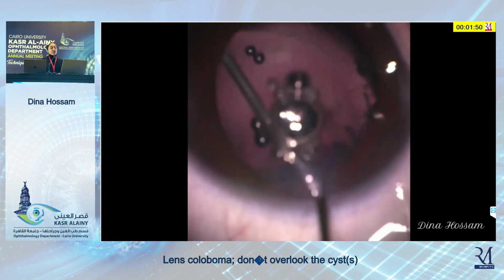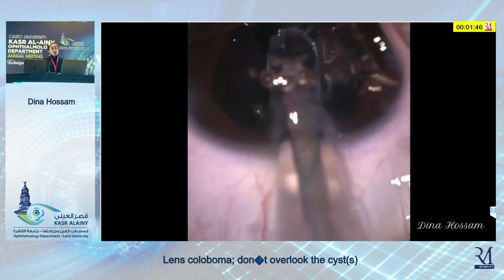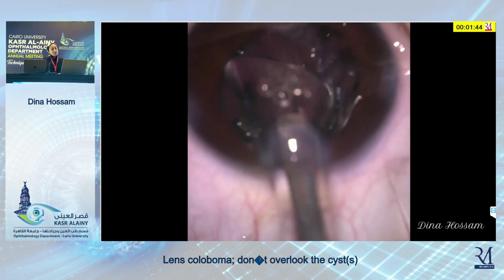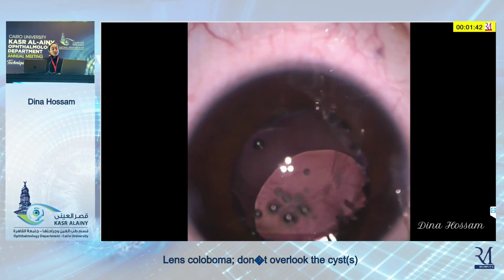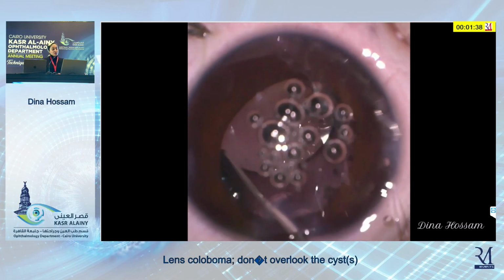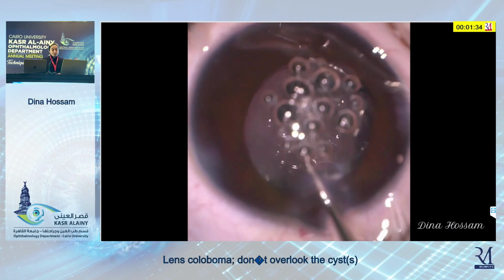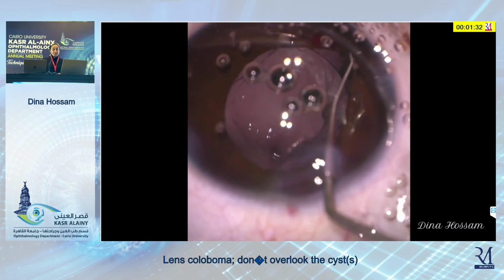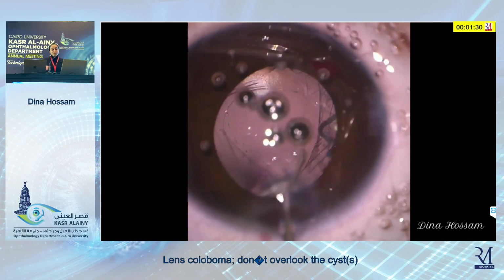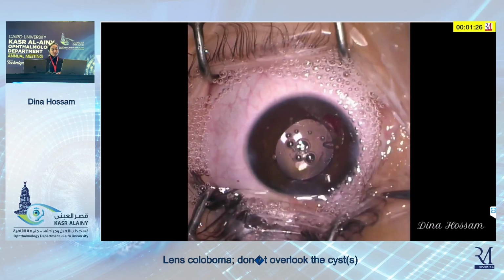And now you have an intact anterior posterior rhexis, and I implanted the three-piece IOL in the ciliary sulcus, and actually unintentionally the optic went into the capsular bag. And here you can see the IOL maintained the central position. Even the haptics pushed the ciliary body processes with the whole bag nasally.